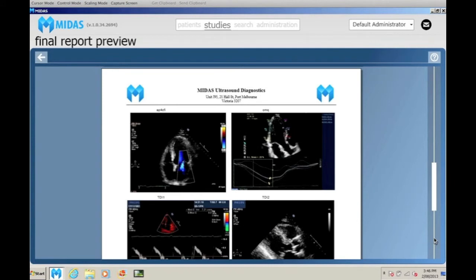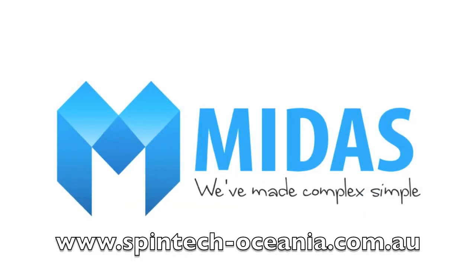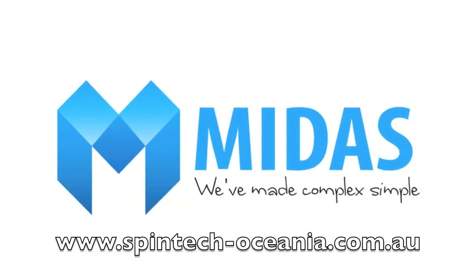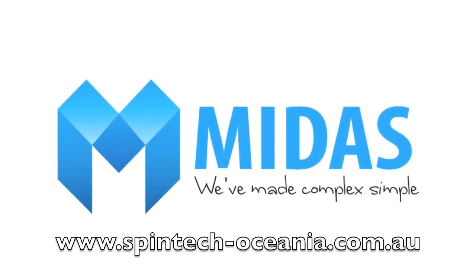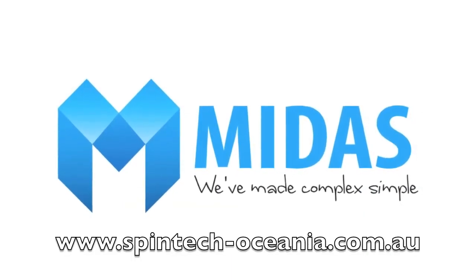Available MIDAS echocardiography exams cover transthoracic, transesophageal, dobutamine and stress echo.